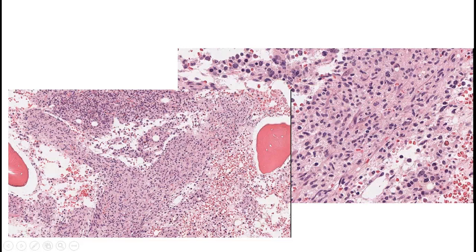In this case, there's a homogeneous pattern of something here. There's also something slightly different here. Look at staining patterns. It's more dense cells. There are some very funny-looking cells. This slide is the same, a blow-up of this area here. You notice that these are very mononuclear cells, and some of the cells, what I call spindle-looking cells. This one almost looks like muscle cells, fibroblasts even. So this one, this one, this one. These are actually abnormal mast cells. Mast cells are a tissue form of basophils.